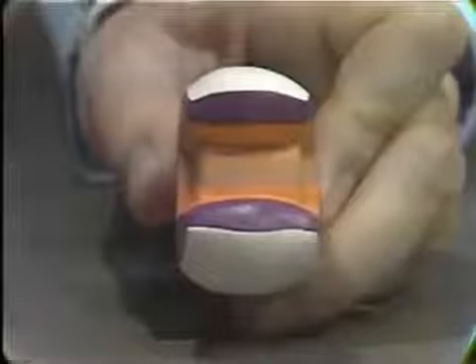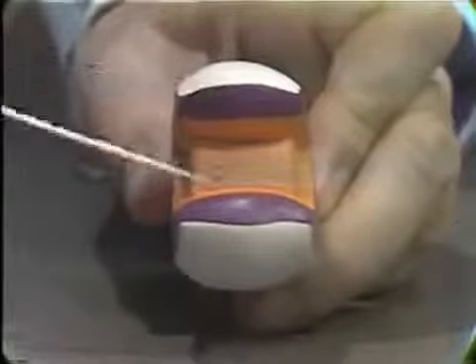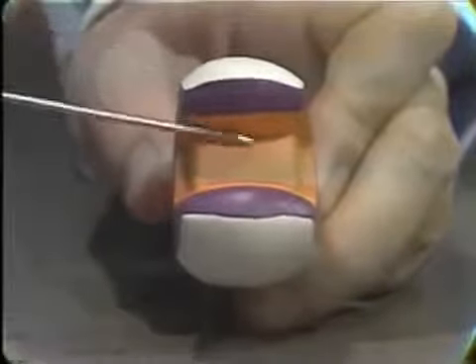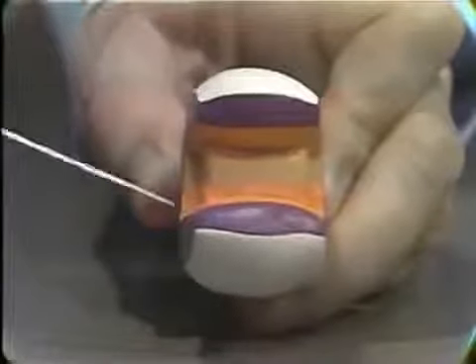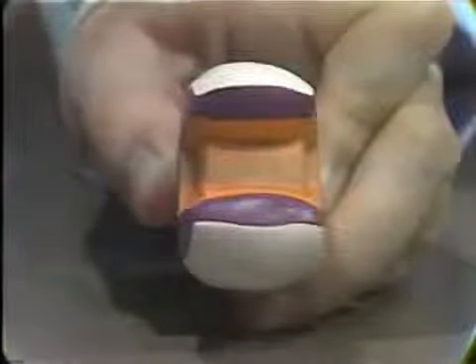And perhaps the most conservative way of converting it into a bridge retainer is to utilize essentially that preparation and just give occlusal protection to the cusps, rather than perhaps going to a three-quarter crown and cutting away more of the lingual cusp, which is already perhaps somewhat cut away by the previous preparation. And you see here a typical MOD preparation in a bicuspid tooth with slices on both mesial and distal surfaces, and the box type of retention going across the occlusal key here with occlusal protection of both buccal and lingual cusps.